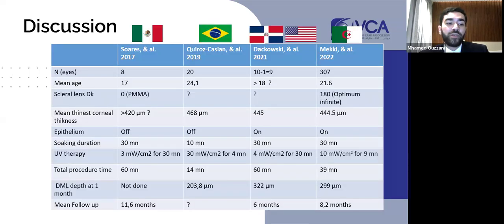This technique is not new. There are some colleagues that already used it, and we don't have a lot of published studies in the literature that describe the efficiency and safety of this technique. We can also see that the material Dk was not evaluated in some studies, but this is very important because we need a high Dk to perform the soaking phase in a safe way.